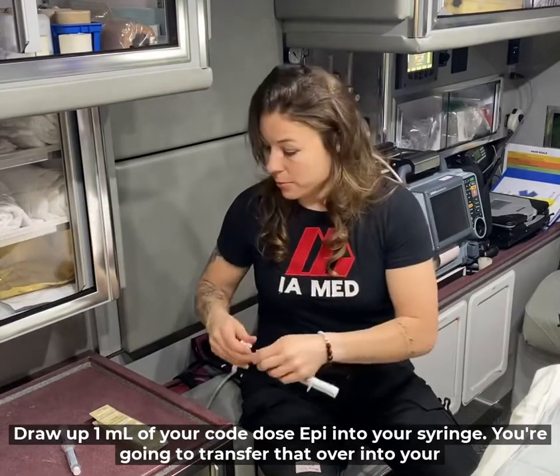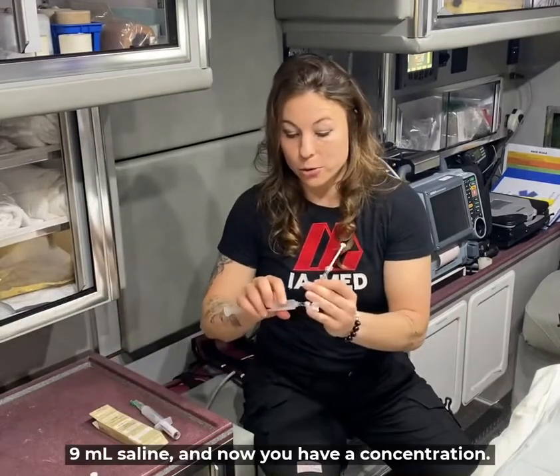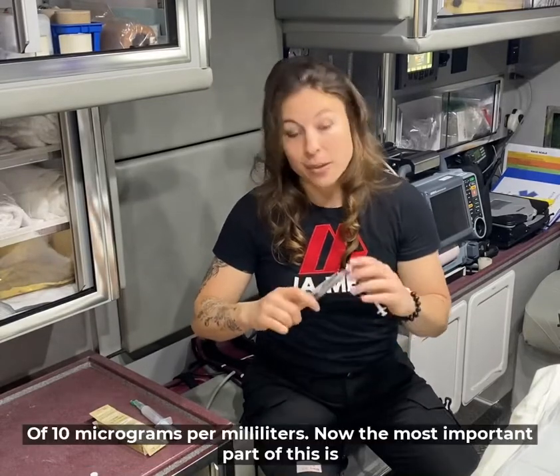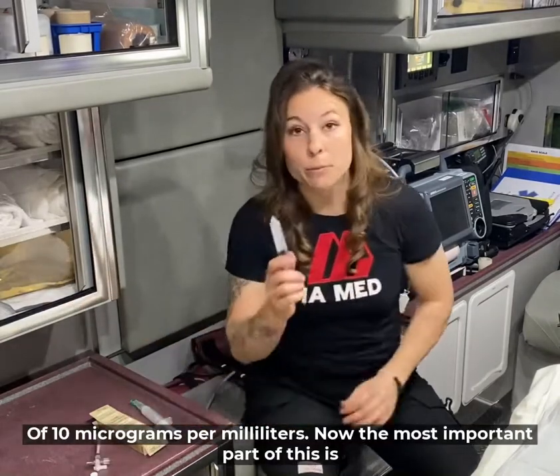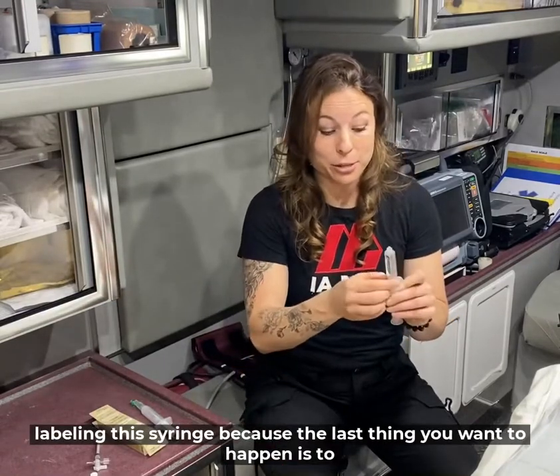Transfer that over into your 9 mil saline and now you have a concentration of 10 micrograms per milliliter. The most important part of this is labeling this syringe, because the last thing you want is to set it down and have somebody else push it thinking it's a flush.